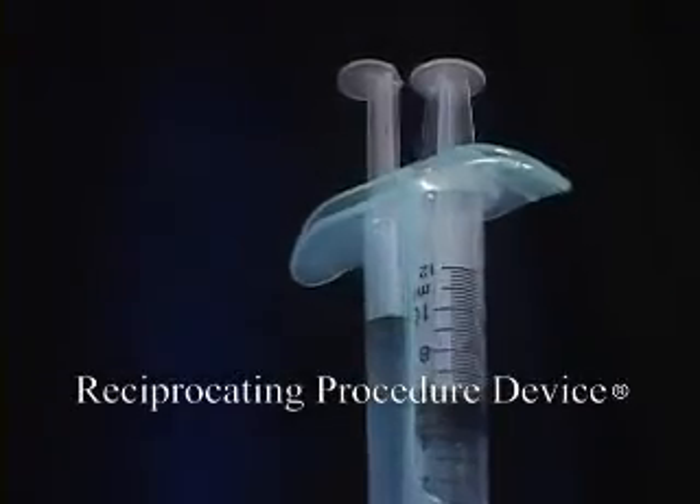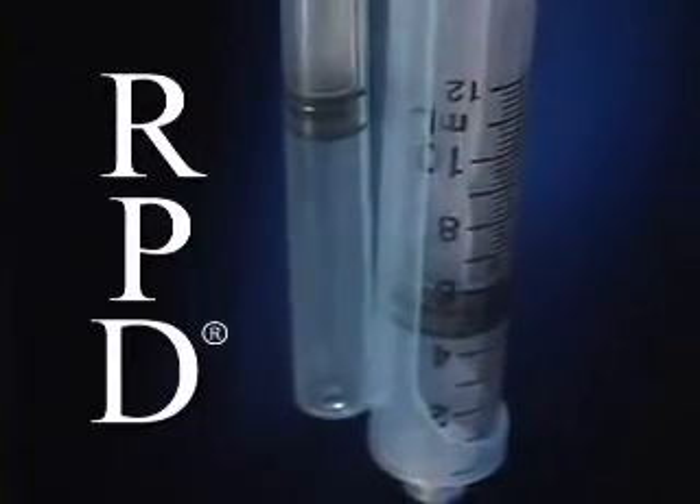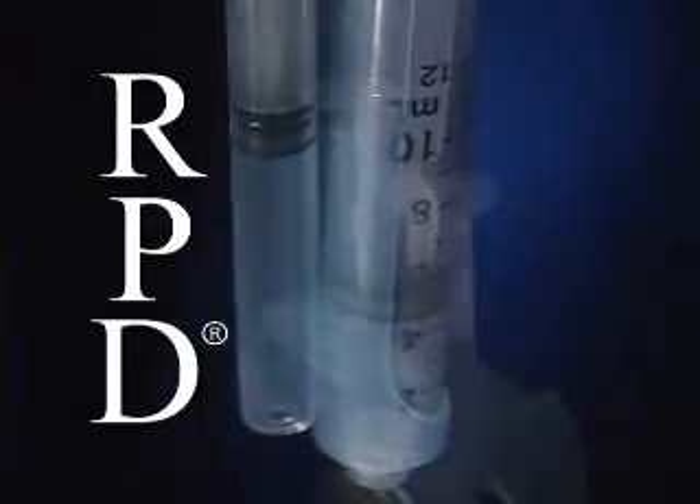The Reciprocating Procedure Device, or RPD, is a one-handed biopsy device that provides vacuum, exceptional needle control, and permits one-handed operation.